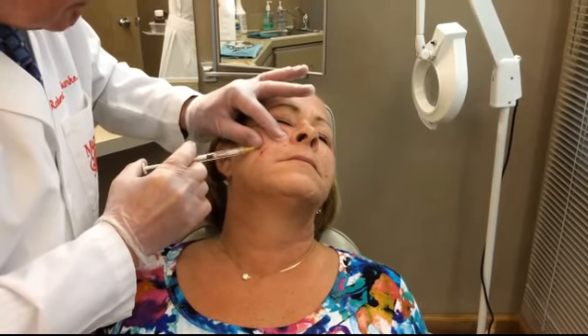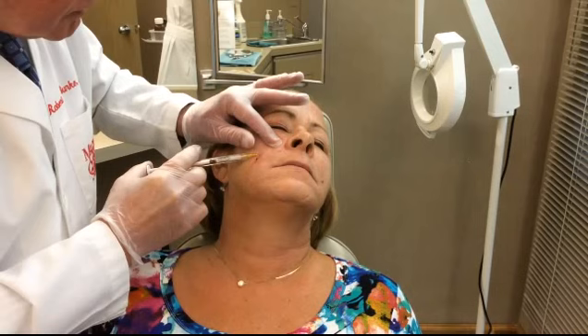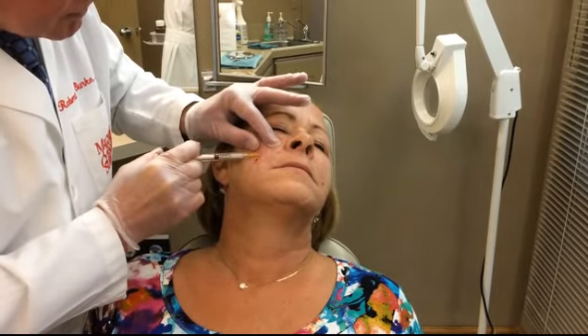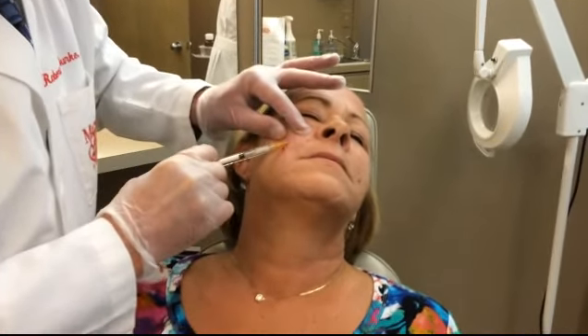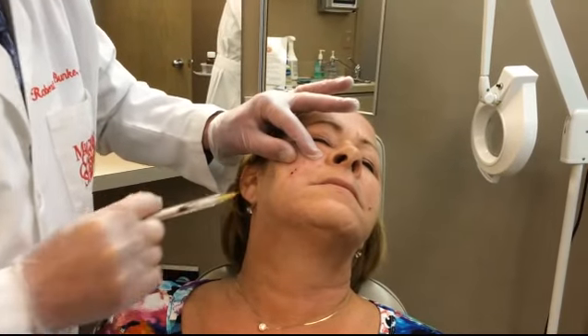You see there's still a little depressed area here. We'll go in a couple different directions. We're going to inject as we pull the needle out, just a little bit — injecting just a little bit in that space that we created.